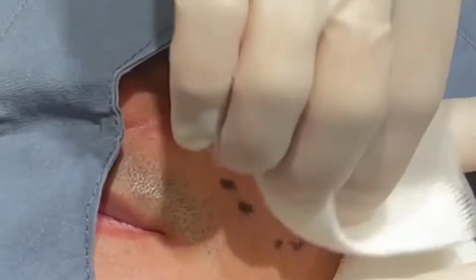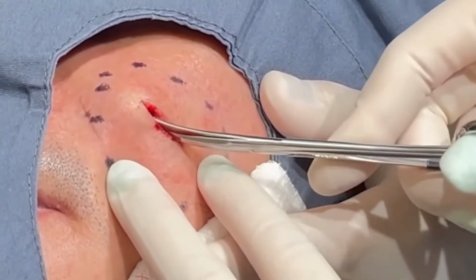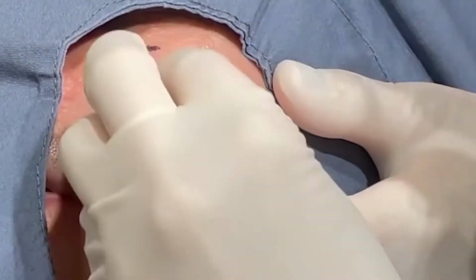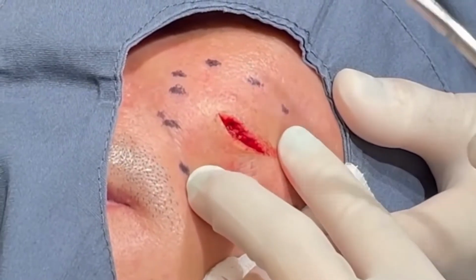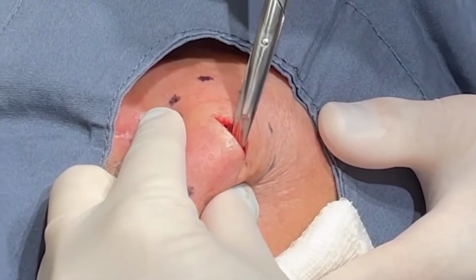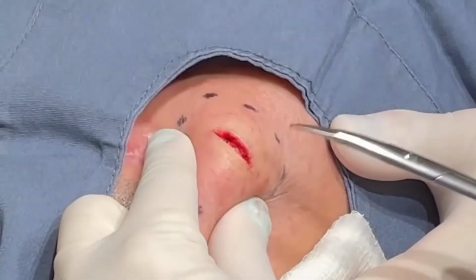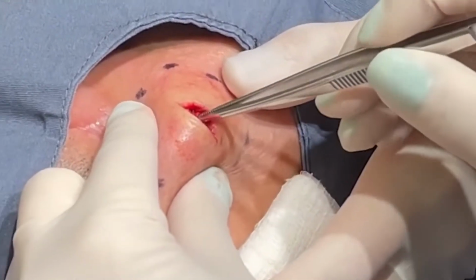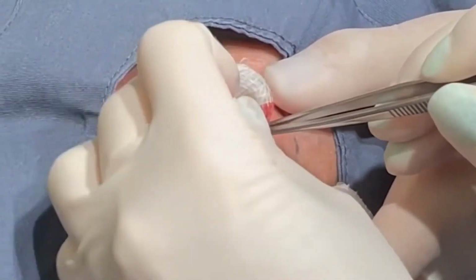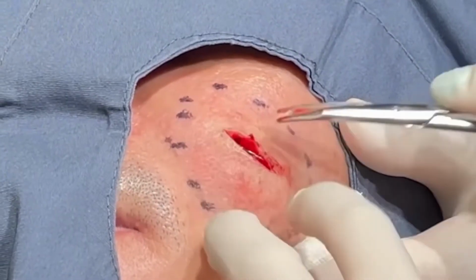Dr. P explained to the man that another doctor had attempted to remove the growth previously, but had failed to do so completely. Lee began the treatment by numbing the area before cutting into the lipoma center with a blade. She next zapped tiny blood vessels in the incision with a cauterizing pen to prevent excessive bleeding. Dr. P next used scissors to snip away at fibers beneath the skin, making it simpler to detect and retrieve the lipoma. She squeezed the skin around the growth with one hand while using the other to tweeze the lipoma.